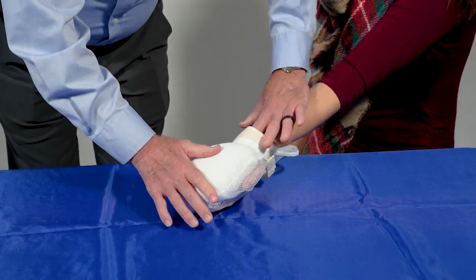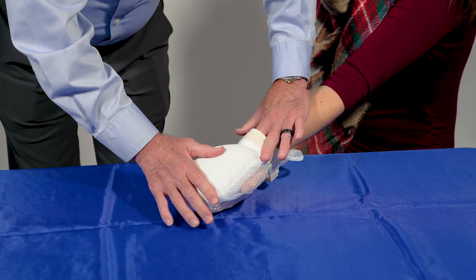Slide one finger flat between the cuff and the inside of the patient's wrist to assure a proper fit.